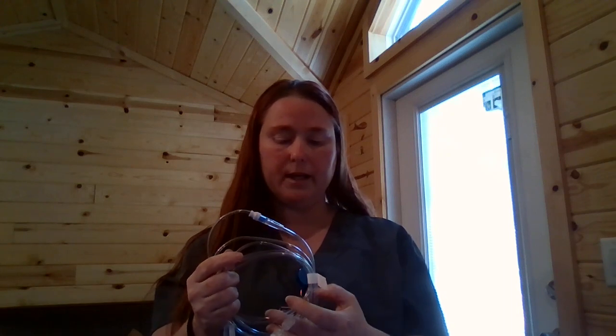This here is the Y site where you would give medications. And this is the adapter end. Now I am going to go introduce myself to my patient, ask them about their allergies, and explain to them that I'm going to be hanging IV fluids.